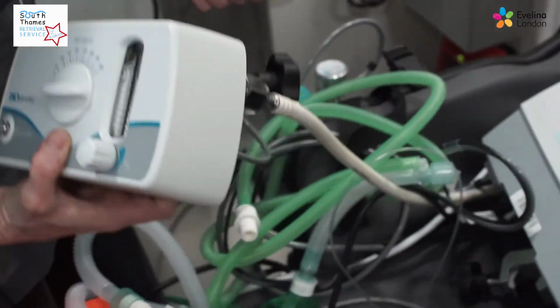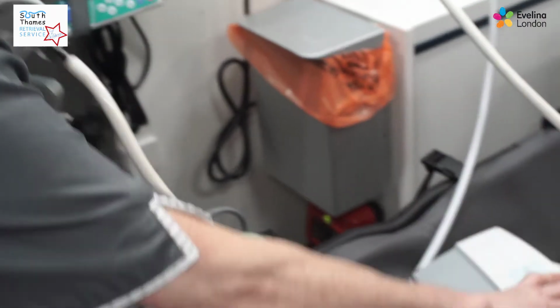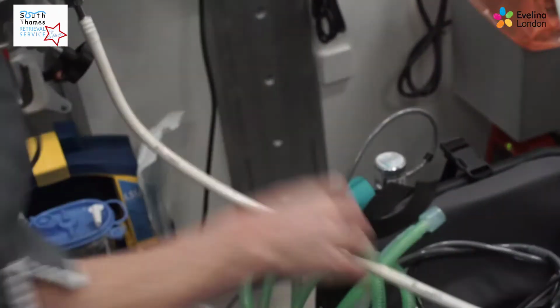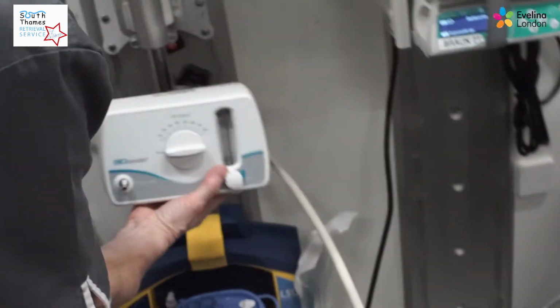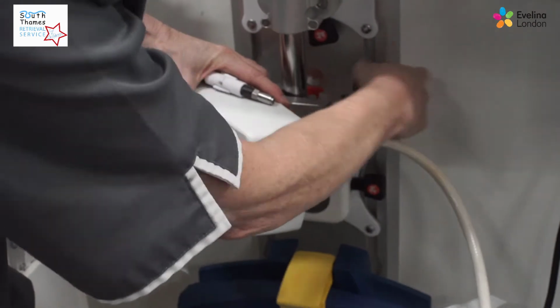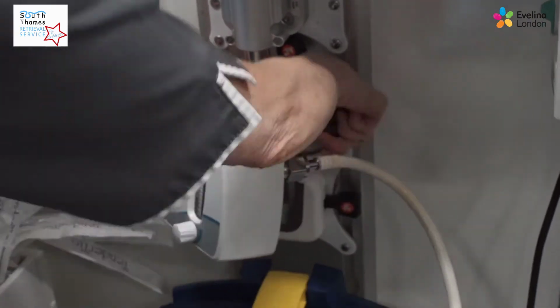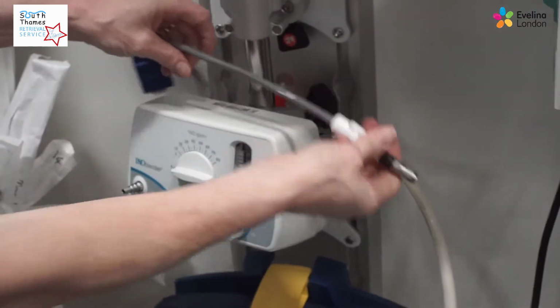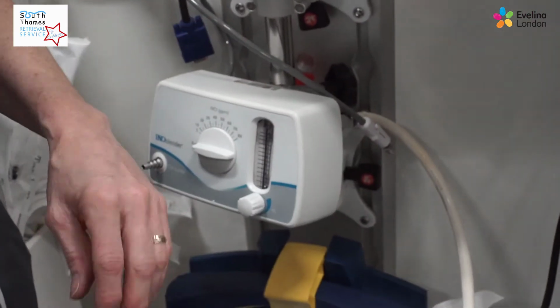It always feels like there's lots of wires at this point. If you do it in a certain order, it does make it much easier for when you're taking it off and putting it with the patient. And then you just secure the blender onto the back of the lower part of the clamp and keep your arm free ready to connect it to the actual monitor. Next you want to actually put the monitor.